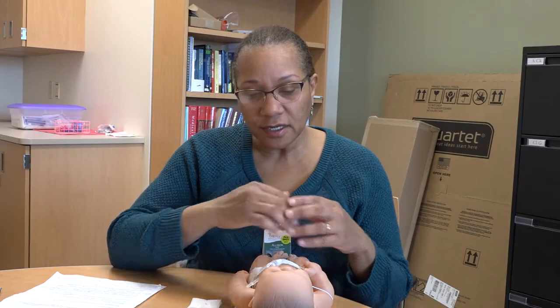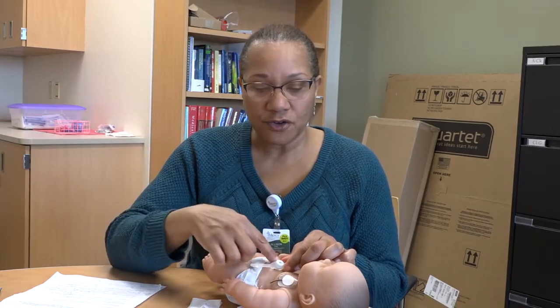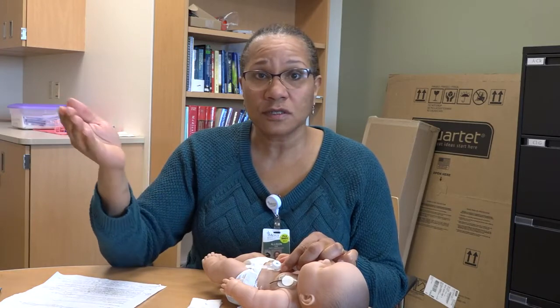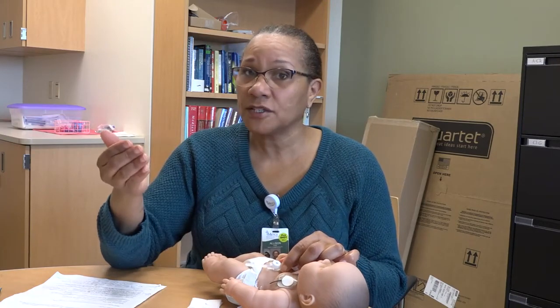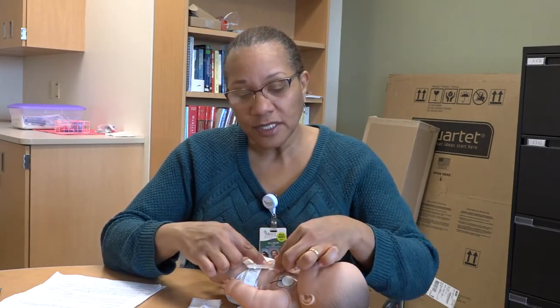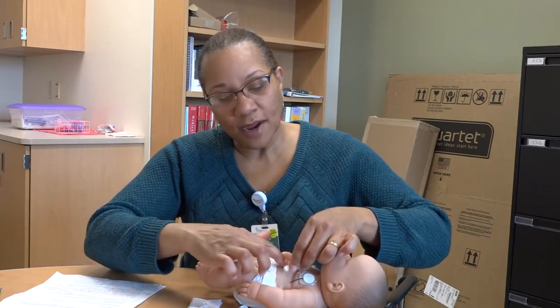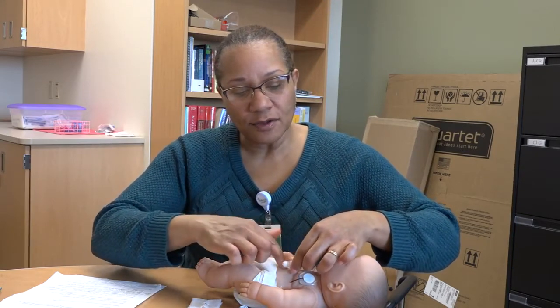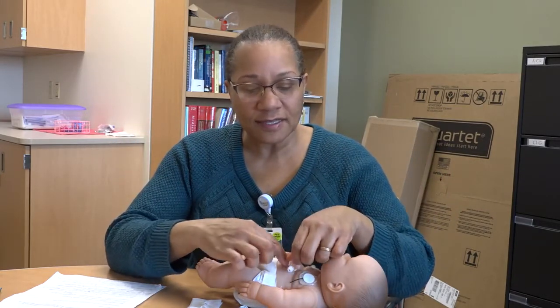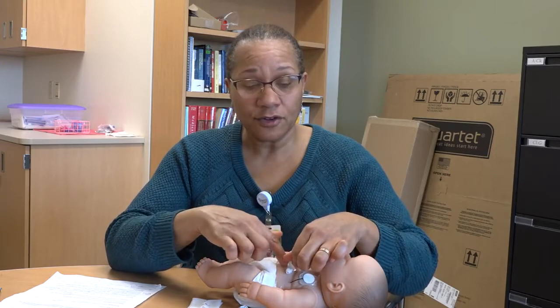When it comes to cleaning the stoma, you're just going to use a warm washcloth with some mild soap and clean around there. You could use just a wet washcloth with water. Sometimes people like to use Q-tips to clean around. While you're cleaning, you're going to be moving the G-tube itself so that you can get all around the site, so you are rotating it. There's no reason to do an actual daily rotation of the tube, because while you're cleaning that site daily, you are turning your tube around so you can get all the way underneath and clean well.